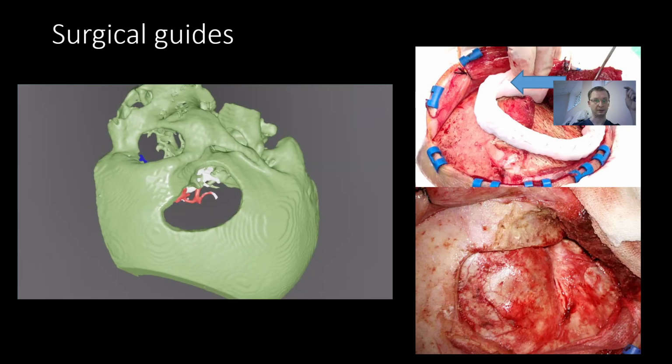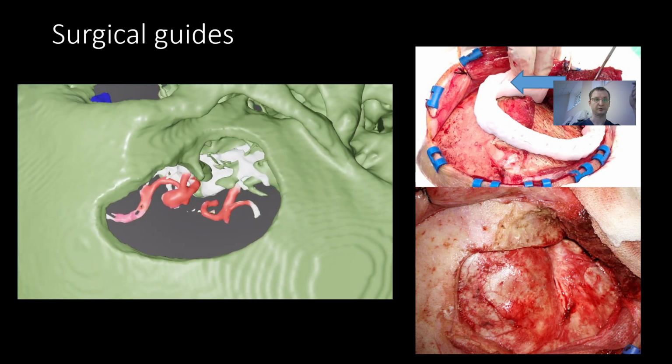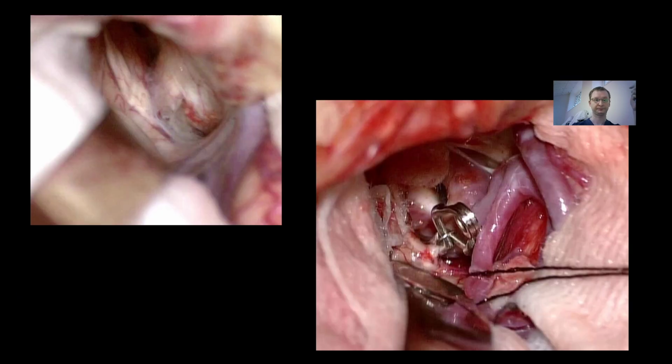Surgical guides are rarely used in neurosurgery, but they can be helpful, as in this case, to perform a craniotomy without opening the large frontal sinus. As you can see, here there is enough space for dissection and clipping despite the unusual approach. Surgical guides can also be used for making bone resection, for example in hyperostosis, when the implantation of an already prepared complex implant is scheduled. Another interesting use is for accurate spinal screw implantation.